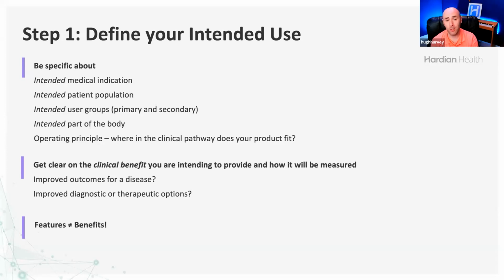So when you're conducting or designing a clinical evaluation, the things you have to think about include measurement of risk versus benefit. So if you were going to conduct an evaluation of, let's say, a thermometer, you would have to make sure that they aren't on average cracking open and leaking mercury into the mouth. And it's the same for software devices. You have to identify your benefits and risks and make sure that you're measuring those in your clinical evaluation.